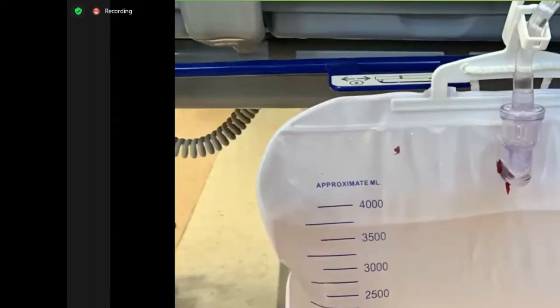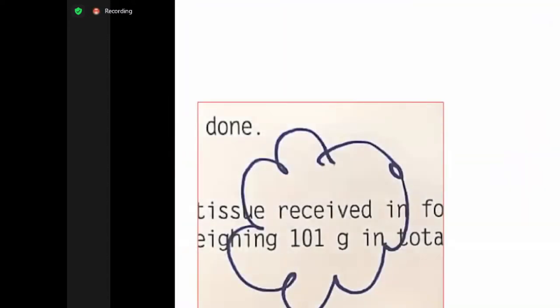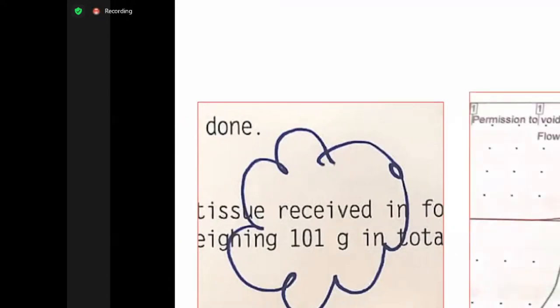And usually you would be able to see clear urine. Nowadays, when I do enucleation, I may not put on irrigation at all. If there's any worry, I put on irrigation, but usually 2 or 3 hours later, if it's very clear like this, I'll just stop it. And I will take off the catheter the next day. It's actually quite common to have 70 gram, 100 gram of prostate enucleated, and having a very good flow is usually what you see. Sometimes it can be up to 70, 80 mL per second. It's actually not very uncommon at all.